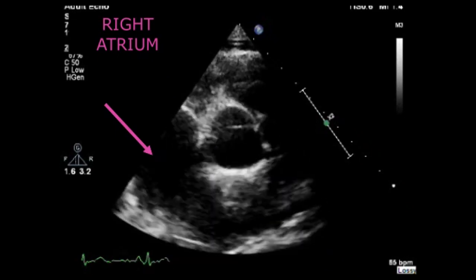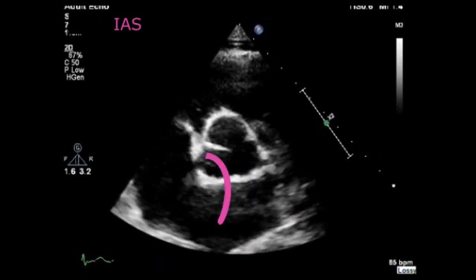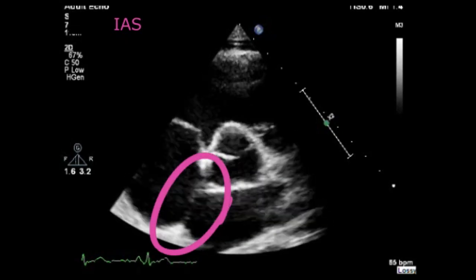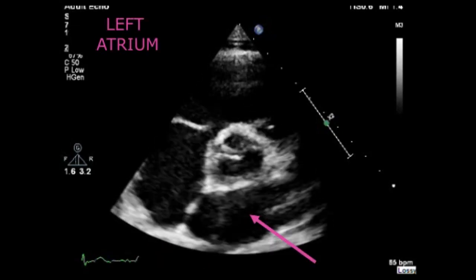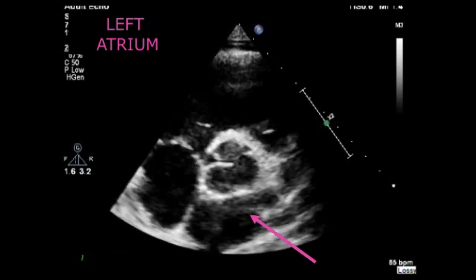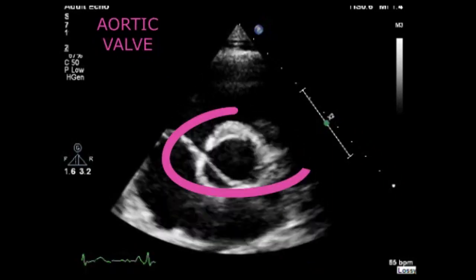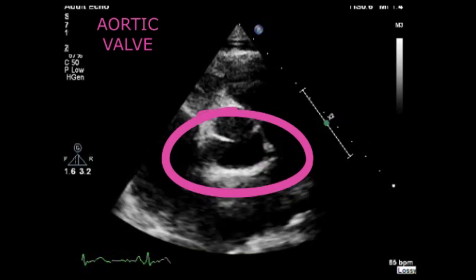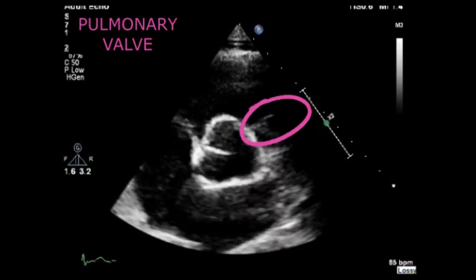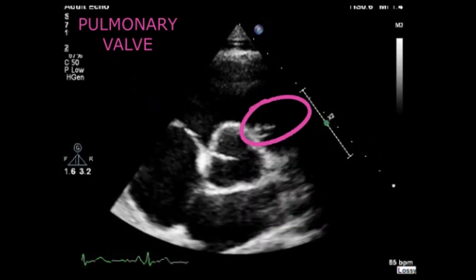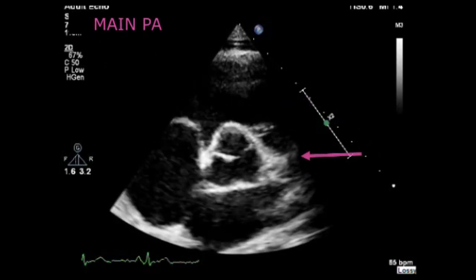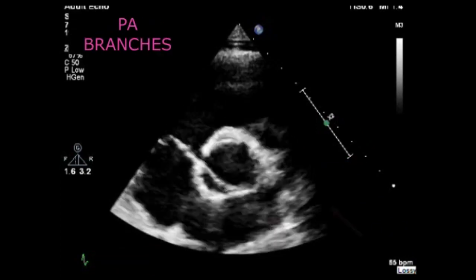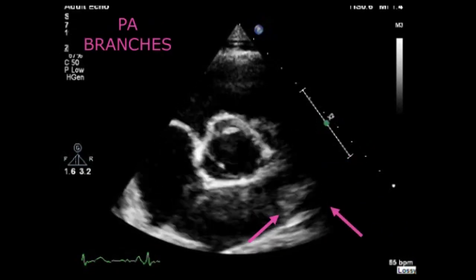The very first valve on the left is the tricuspid valve. Under the tricuspid valve we have the right atrium. The line at the bottom dividing two chambers is the interatrial septum, and the next echo-free space is the left atrium. The valve in the middle is the aortic valve where we can differentiate all three cusps. The first valve on the right hand side is the pulmonary valve, under which we find the main pulmonary artery and the pulmonary artery branches.